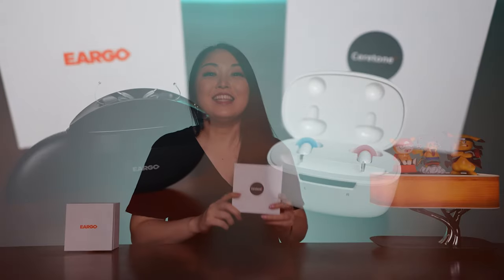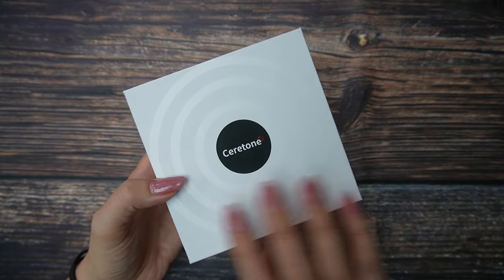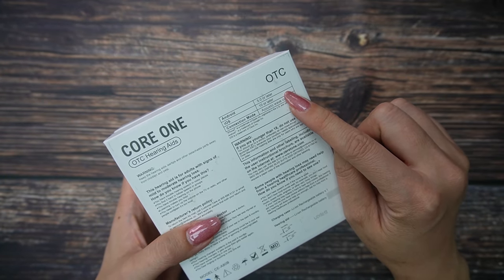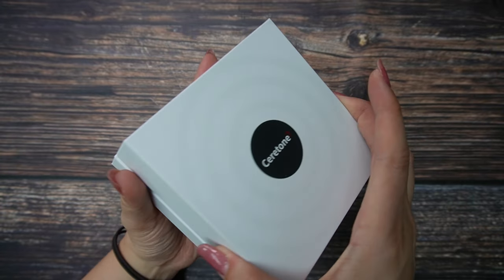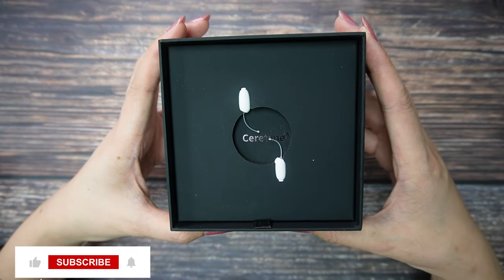Before I start to test, let's do a quick unboxing. This is the Ceretone box. As you can see, the design is really beautiful and looks expensive. Here on the back you can see the indicator — you can use it with Android and iOS. So now let's open to check what is inside. They include some manual and the hearing aids.